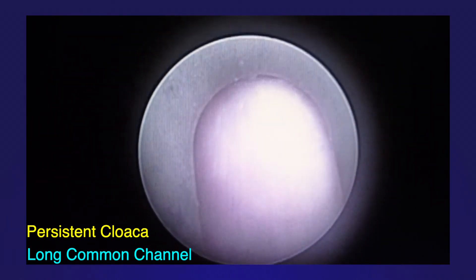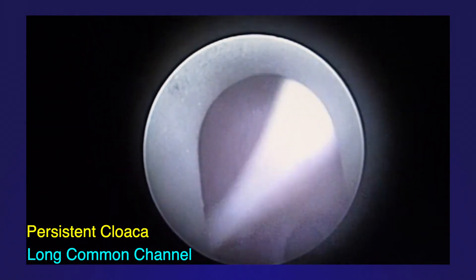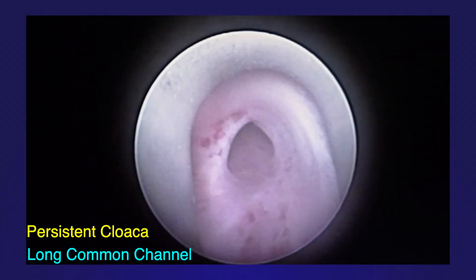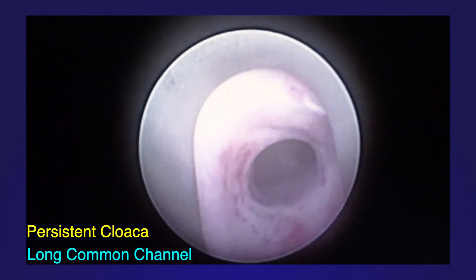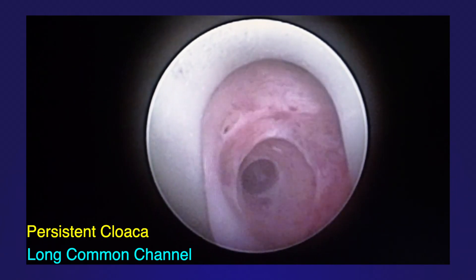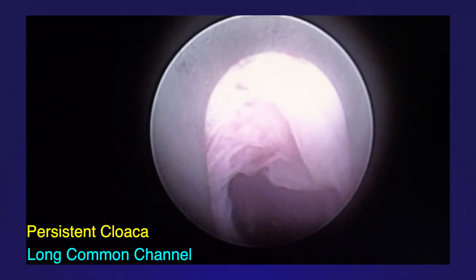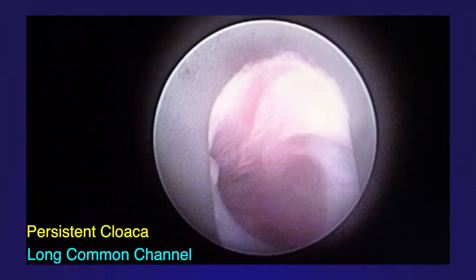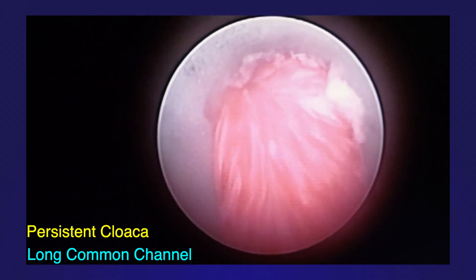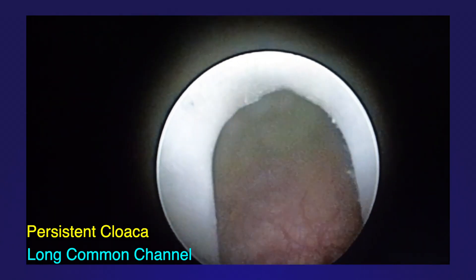Each hemivagina terminates in a cervical os. The rectal opening into the cloaca is seen posterior to the reproductive tract. As the cystoscope is withdrawn, the urethral orifice again comes into view. Advancing the scope through that orifice leads into the bladder neck and urinary bladder. In this case, the common channel measured approximately 6 centimeters.